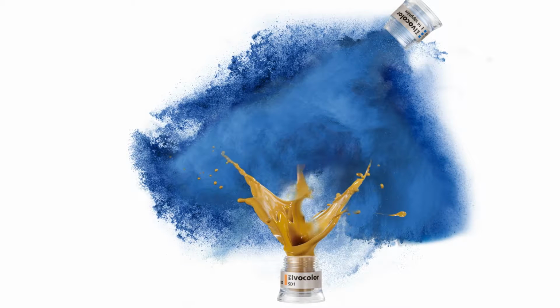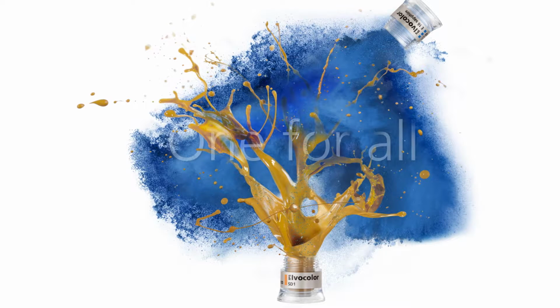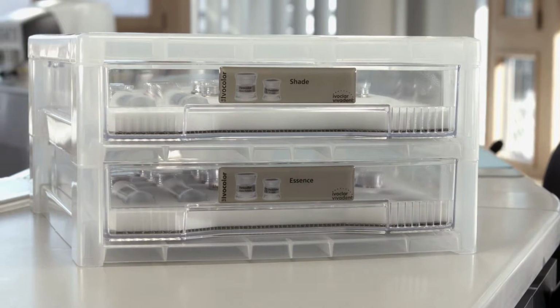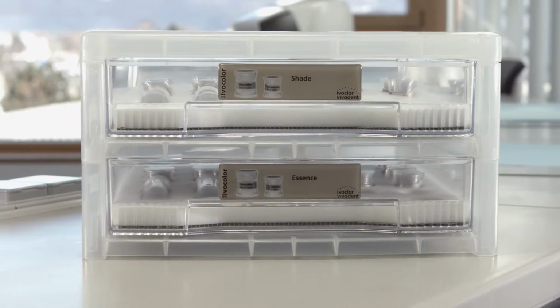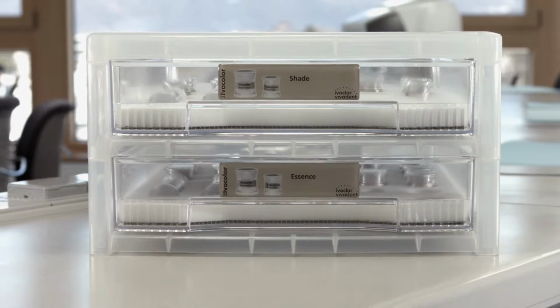IPS Ivocolor is a universal stain and glaze system for the individual characterization of pressed ceramics, CAD-produced restorations, and layering ceramics from Ivoclar Vivadent and Xenostar from Wieland Dental. The stain and glaze assortment is available as a starter kit, shade kit, essence kit, and in single refills.